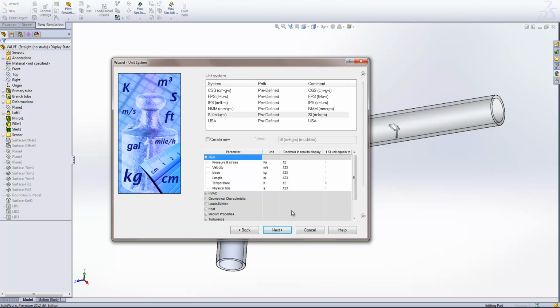Okay, next, the system asks us to specify our unit system. So here we're going to use the standard SI system, but we could by all means use any of the others you see in the list here. For example, our friends across the pond might use the USA unit set, which is essentially just all imperial values. We're not going to do that, we're going to stick with the SI units.